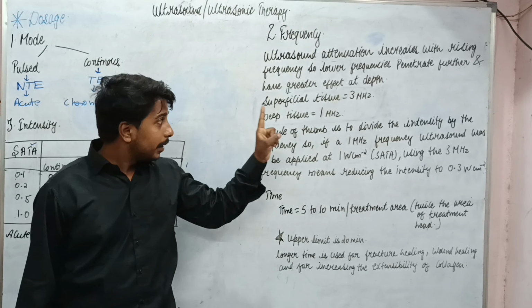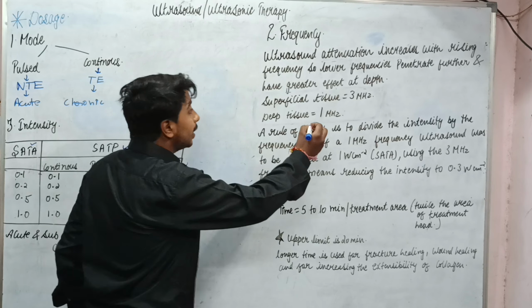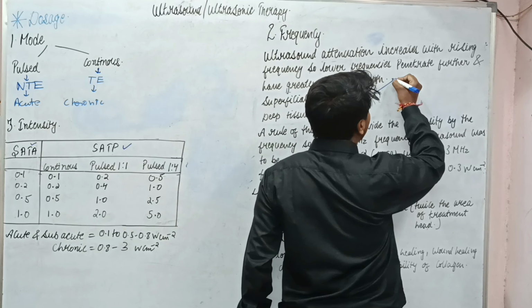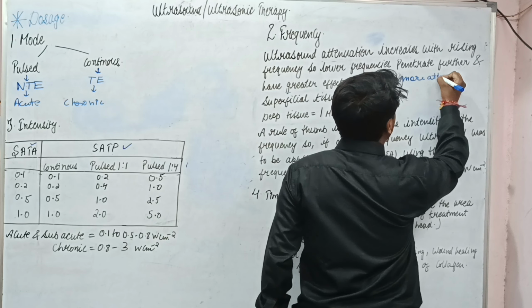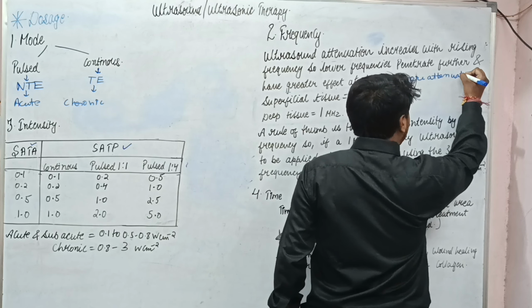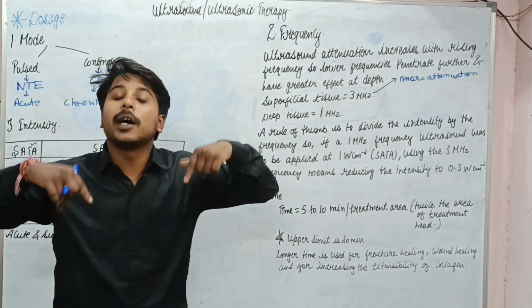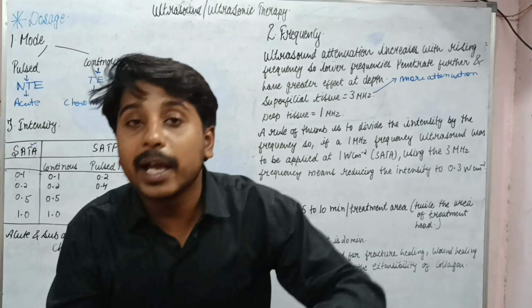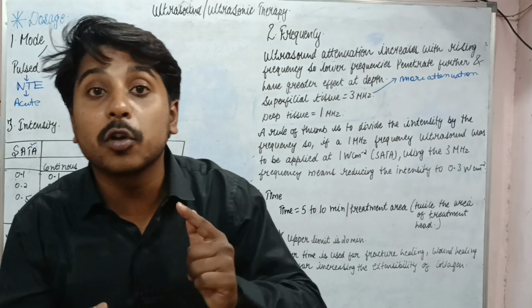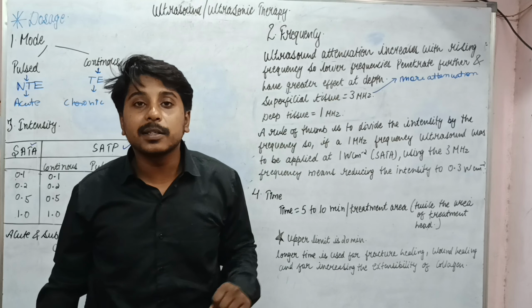Next, the important thing is that if I am saying 3 megahertz has more attenuation, it means that reflection, refraction and absorption are occurring more with 3 megahertz ultrasound.